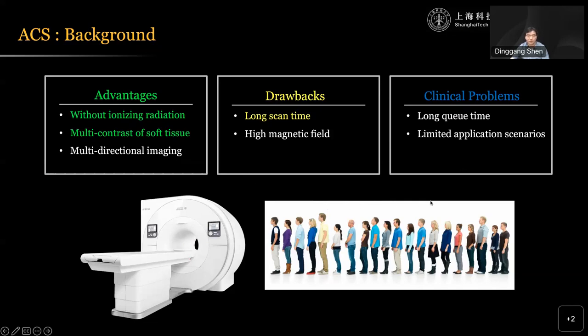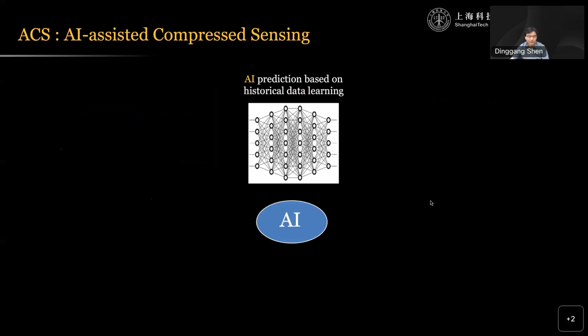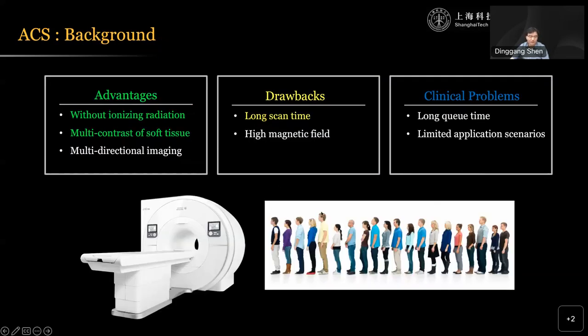So in this way, we hope to develop a deep learning algorithm, and then we can do the fast reconstruction. For example, in US brain-related studies, we usually take 30 minutes or 40 minutes to scan the multiple modality MRI imaging. And in China, in the hospital, they simplify the imaging protocols, trying to reduce the scanning time from, for example, 30 minutes to 15 minutes or 12 minutes. Of course, the quality will be reduced.